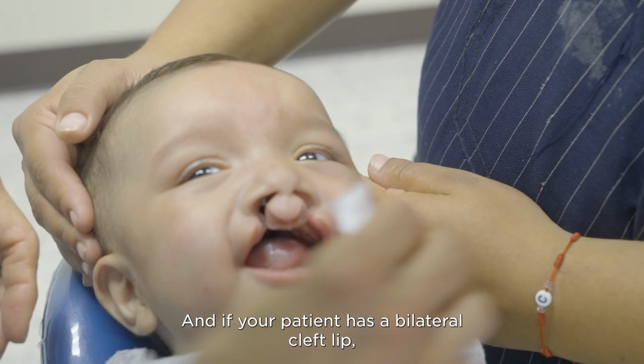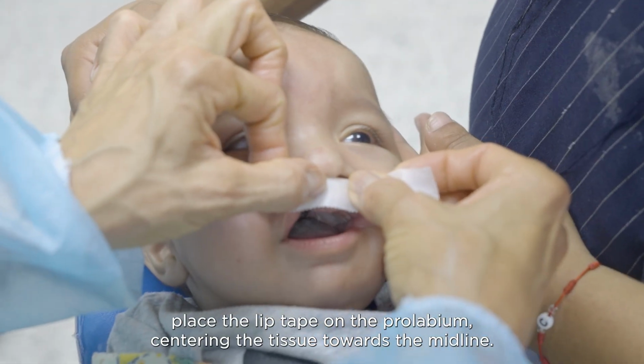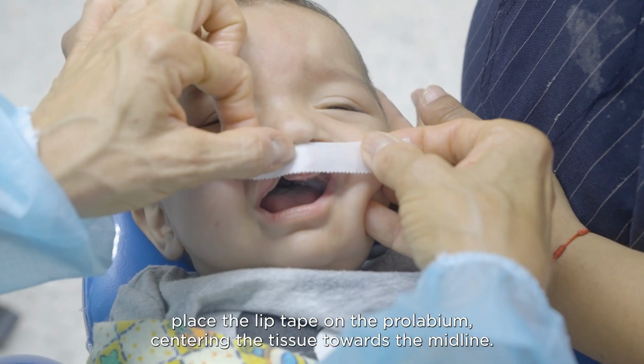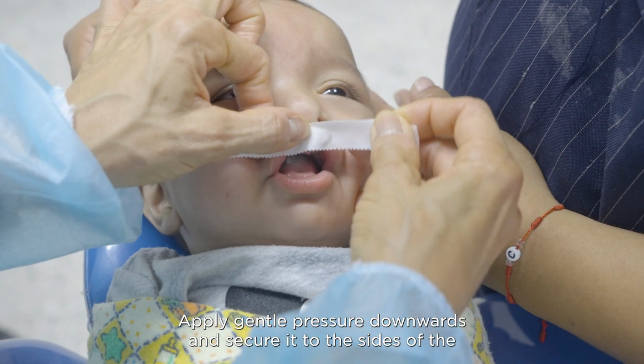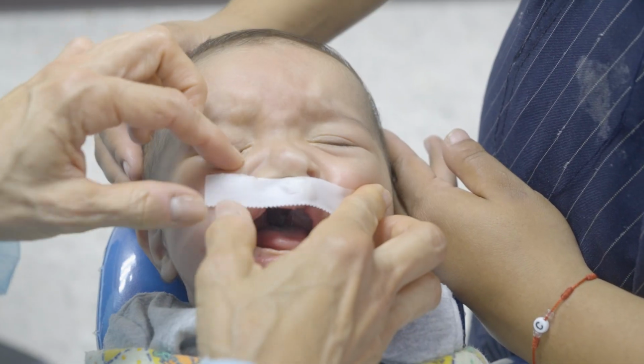And if your patient has a bilateral cleft lip, place the lip tape on the prolabium, centering the tissue towards the midline. Apply gentle pressure downwards and secure it to the sides of the lips on both sides.